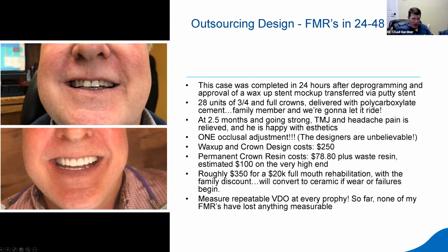Again, he's a family member of mine. We'll get to that, but I keep measuring his VDO every time he comes in for a prophy, which was about 2 weeks ago, and I can't find anything where he's lost any VDO. Again, it hasn't been that long, but I'm very optimistic about this material.